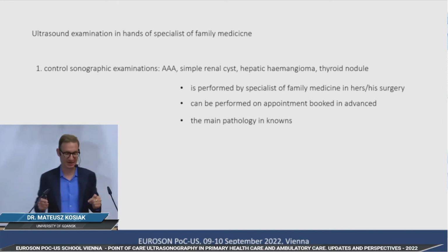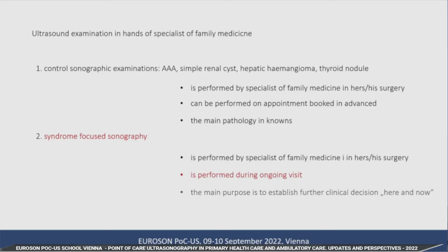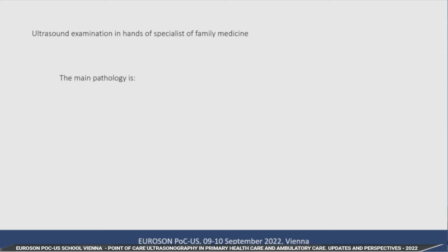But in this lecture we will focus on the other one, syndrome-focused sonography, which is a sonographic examination performed by specialists of family medicine in his/her surgery, and it's performed during the ongoing visit. And the main purpose of this examination is to establish further clinical decisions, here and now. And the pathology is not known yet, but suspected.